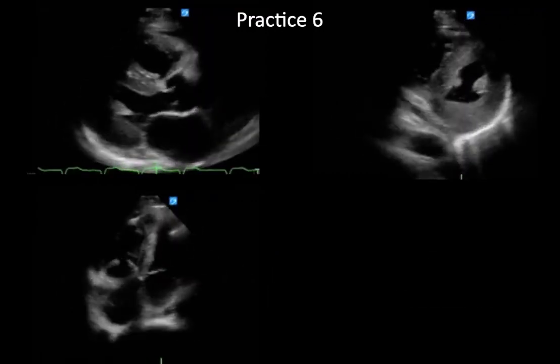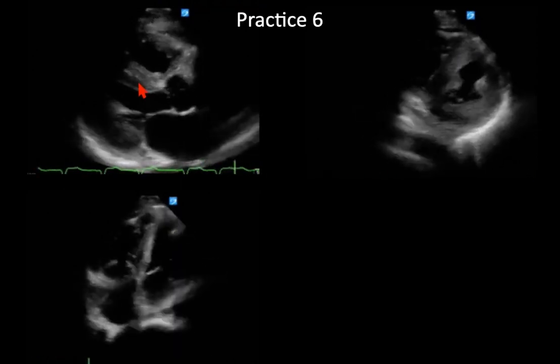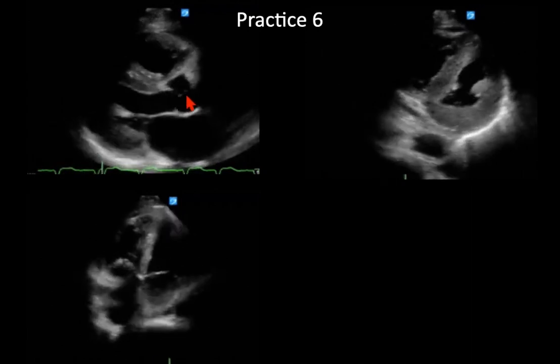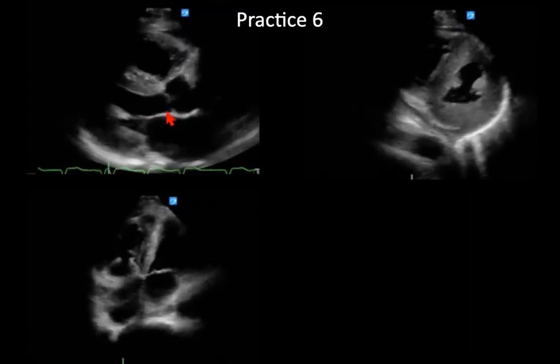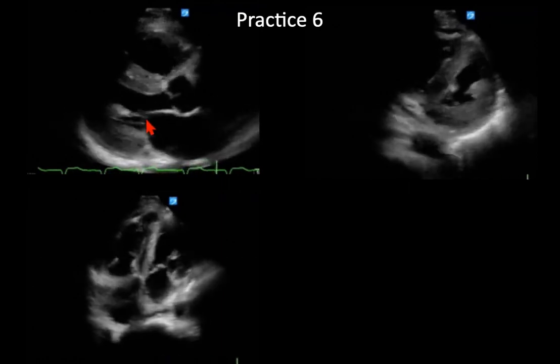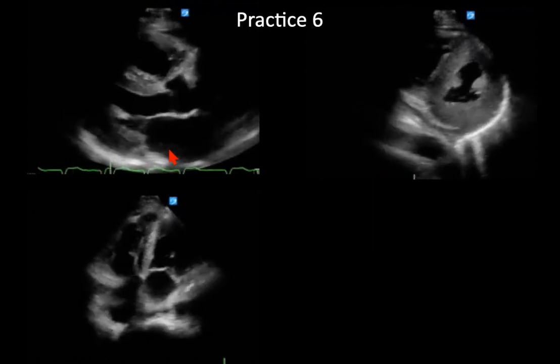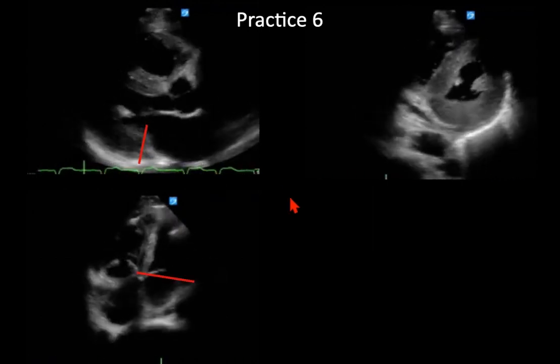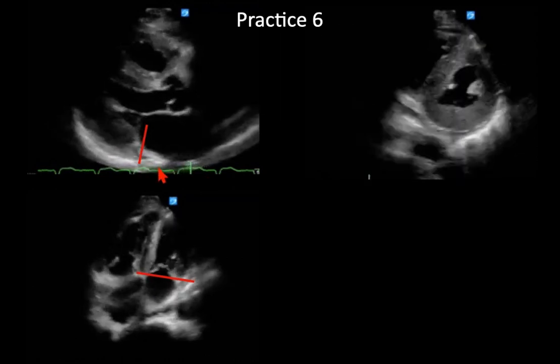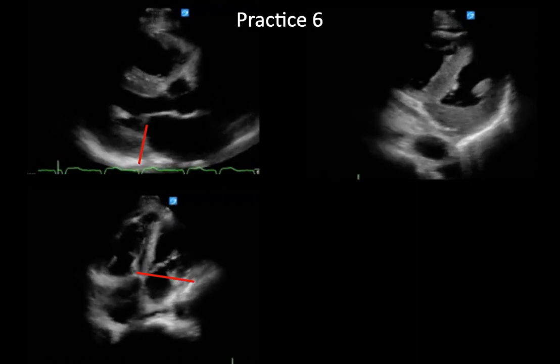Case number 6 here, you can see that the myocardial muscles are hypertrophic. But these already thick muscles are not showing that much thickening and shortening during systole. The mitral valve anterior leaflet opens much less than halfway the distance towards the septum. Axial and longitudinal LV diameters also show very minimal change during contraction. Let's take a look at the mitral annulus excursion. Yeah, it's very poor. So this is severely reduced contractility.